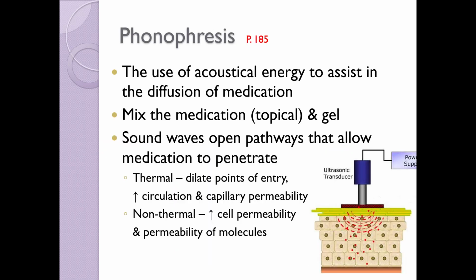Phonophoresis is the use of ultrasound or acoustical energy to help move a topical medium into tissues. The theory is that ultrasound enhances transdermal drug delivery by dilating hair follicles and sweat glands, and increasing circulation and kinetic energy of the local cells. The thermal effects of ultrasound increase the kinetic energy of both the local cells and the medication.